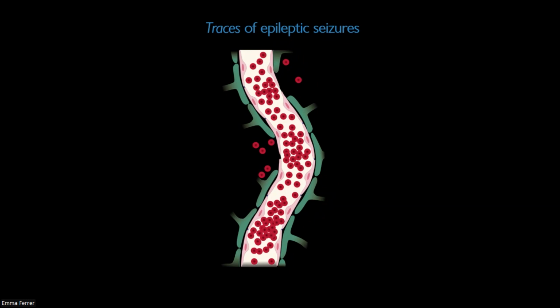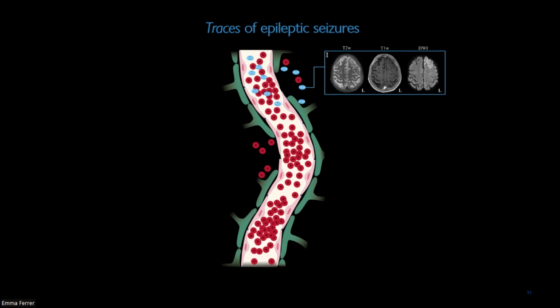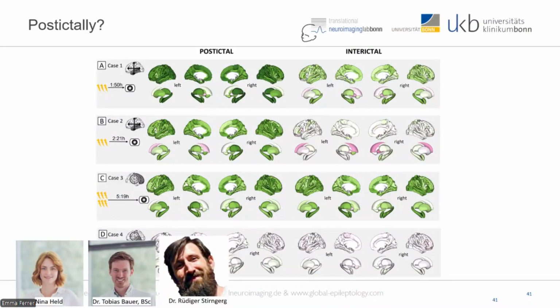And you may try to sensitize the MRI signal to different structural underpinnings. So some of them really were in the scan 45 minutes or so after they had a seizure. And that's a unique view, basically, in the brain, and a view that necessitates 7 Tesla, because you're not able to show this very small, subtle difference in susceptibility under 3T.